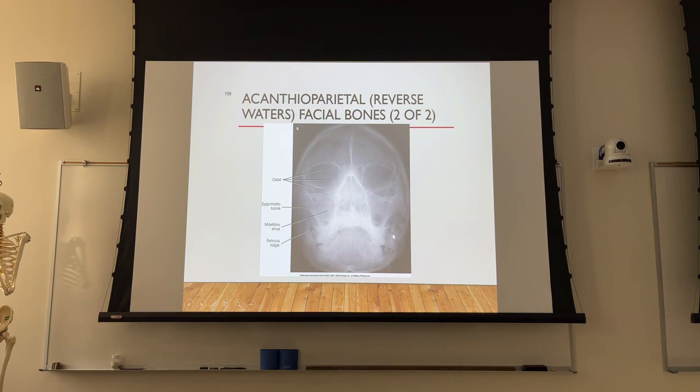That's a reverse waters. Again, you can't really see, it looks like the patient has a maxillary sinus infection here. And what you're missing here, really, is the odontoid process. So this is a phantom. It's a real bone phantom, but whenever they acrylicize this one, chances are that filled up with acrylic, and it makes it look like the patient has a sinus infection. It's kind of cool. This one's more open. That one's completely occluded. That's what a sinus infection would look like.